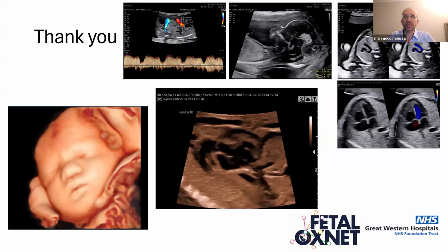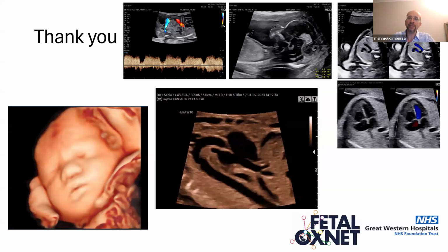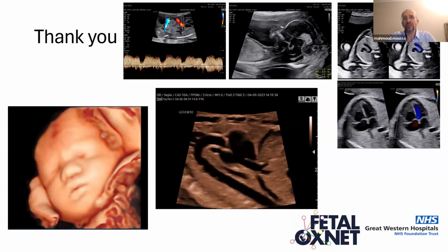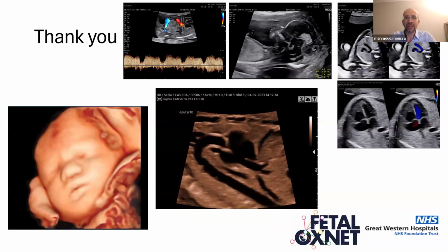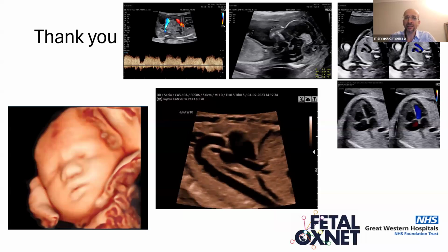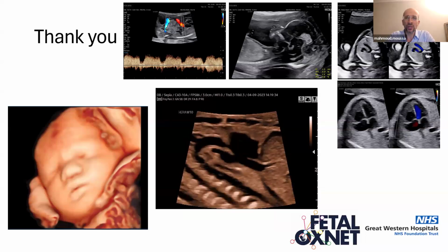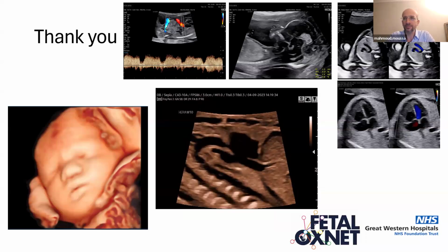So this was just an overview about how to use this very simple and useful plane in your cardiac assessment for the fetus. Always think about the heart and examine the baby's heart and not the planes, and adjust your machine, and you will most probably get a very good detection rate for your cardiac examination. Thank you for joining and listening today, and I'm very pleased to be with you all.